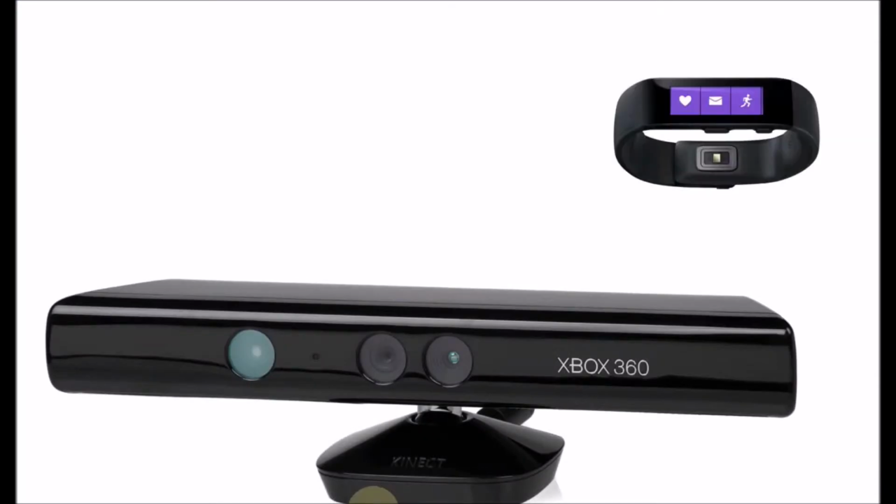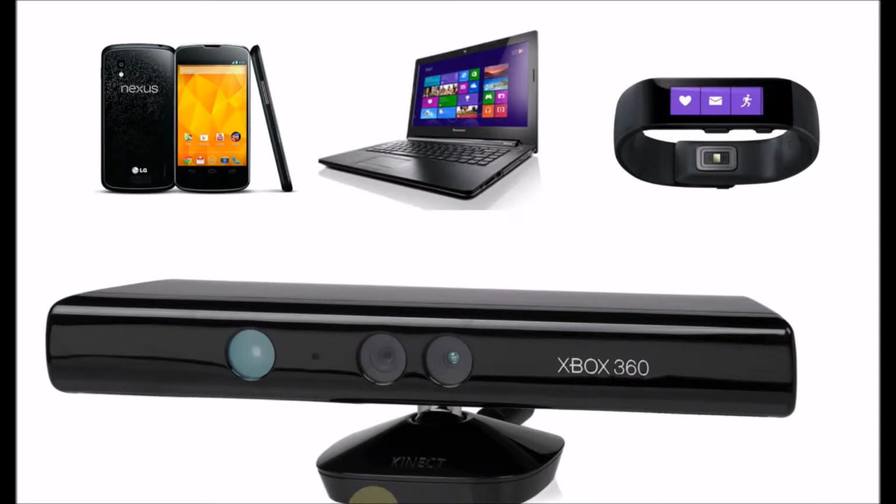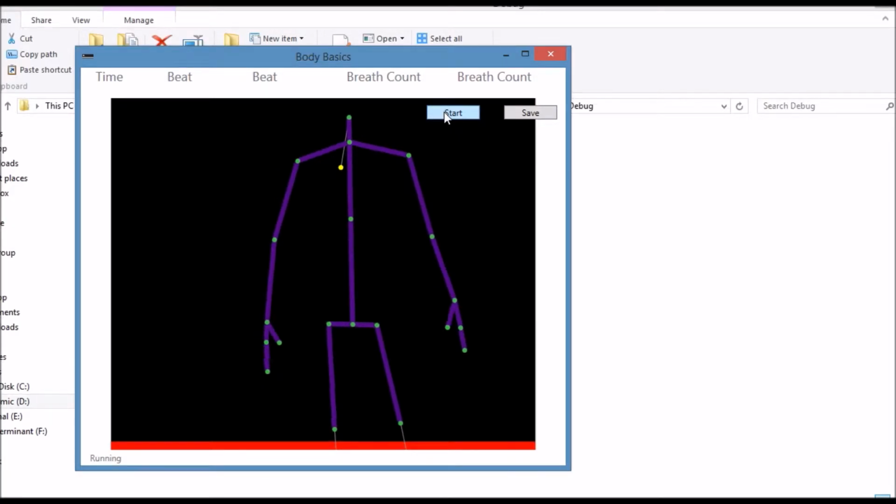In this project we used a Microsoft Kinect version 2, a Microsoft Band, a Nexus 4 smartphone, and a laptop. Let's start the demo. We start our WPF app that is showing the human skeleton. We have to press the start button, putting the Microsoft Band in the front pocket of the subject. Then the subject is asked to breathe normally toward Kinect.